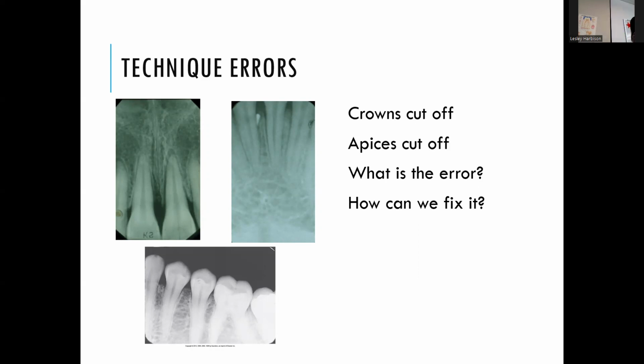Seat it for them, because if they feel what it's going to feel like, it won't feel any worse than when you seat it. You'll put it all the way down, push it down to the mandible or the occlusal surface of the mandibular teeth, and then have them bite, it'll essentially feel the same. But if you float it in there and it's just hanging in the midst, and then they have to close to push it down, they'll never want to push it down. So that's the biggest trick: seat it fully for them first, and practice that with Dexter.